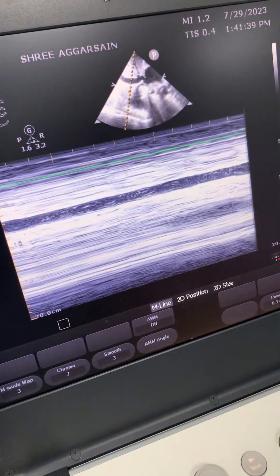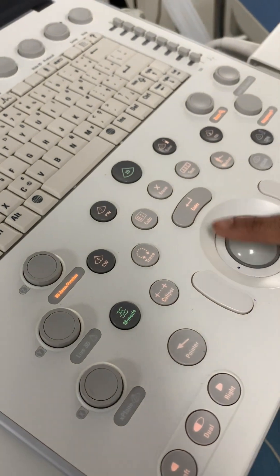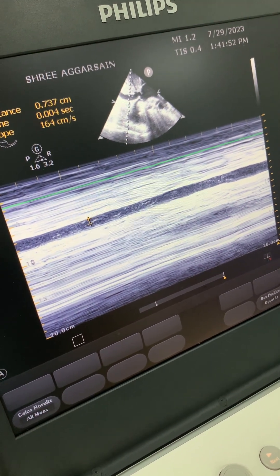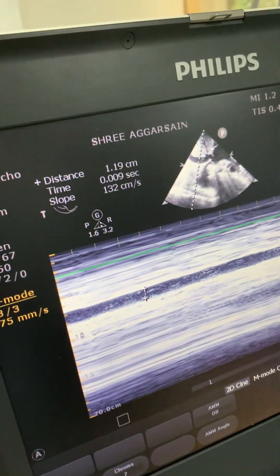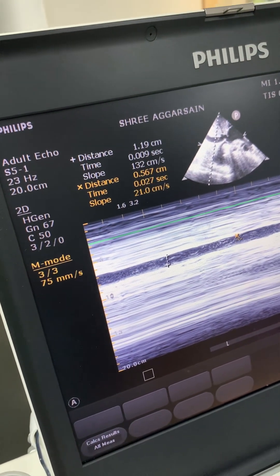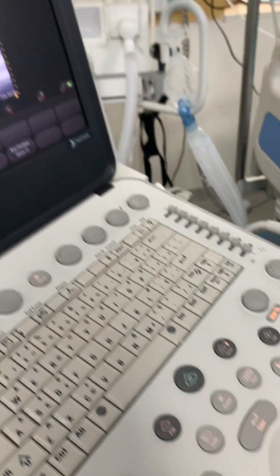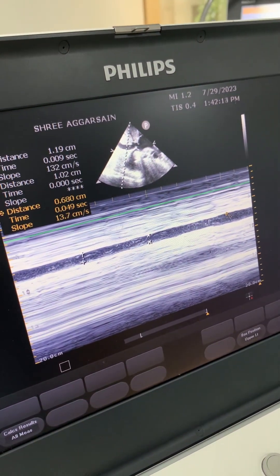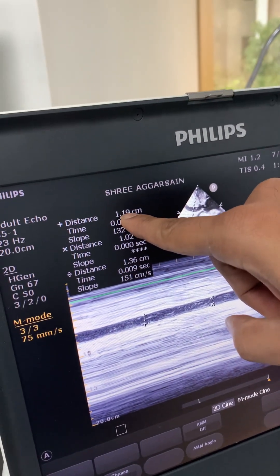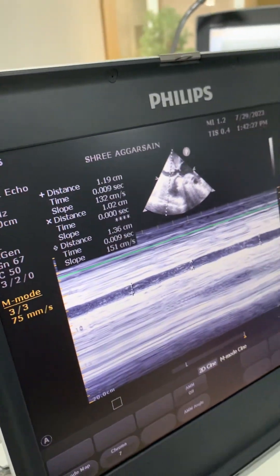Now we have the IVC on M-mode. We use the caliper to measure — the first reading is 1.19. Always take three consecutive readings and never rely on just one. The second reading is around 1.02, and the third gives us the maximum and minimum diameter. With readings of 1.36, 1.02, and 1.19, we add all three and divide by three to get the mean diameter.